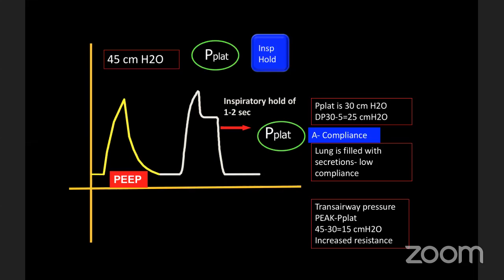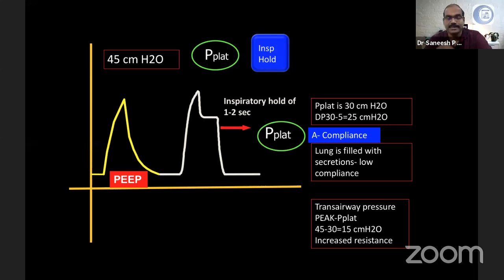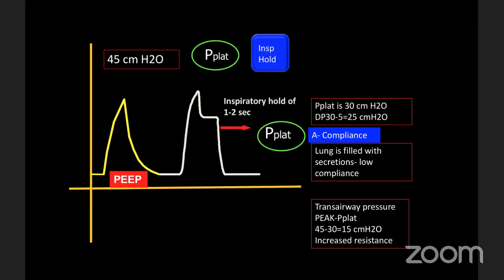So we have to know whether it's a resistance problem or a compliance problem. It is not about blindly giving nebulization. Blindly going for bronchodilation may not always work. Sir, when should we think there is a compliance problem is what I wanted to know, sir.